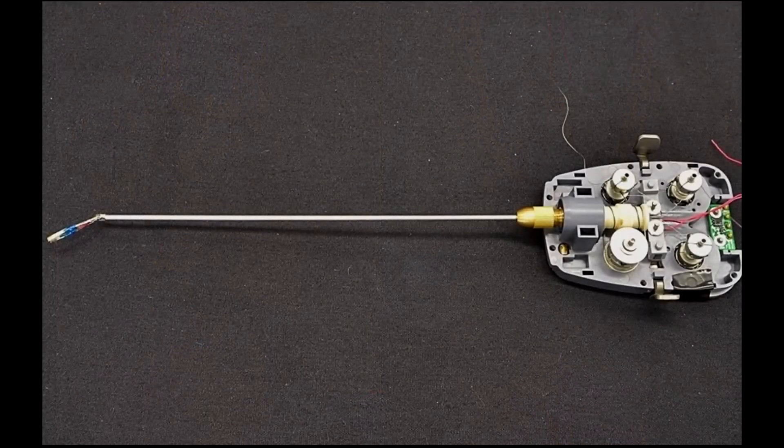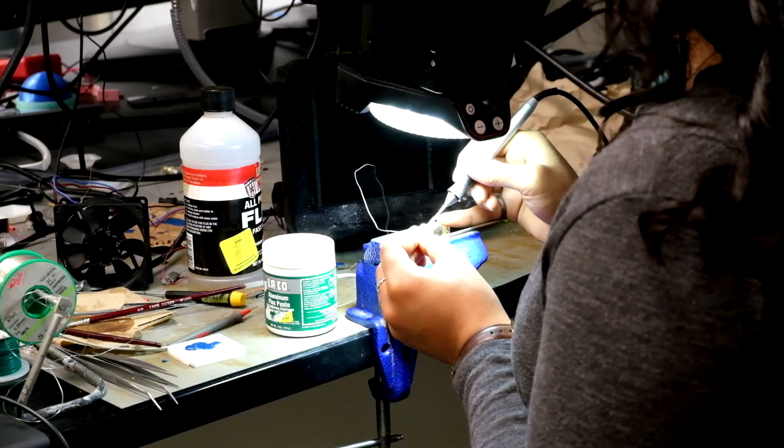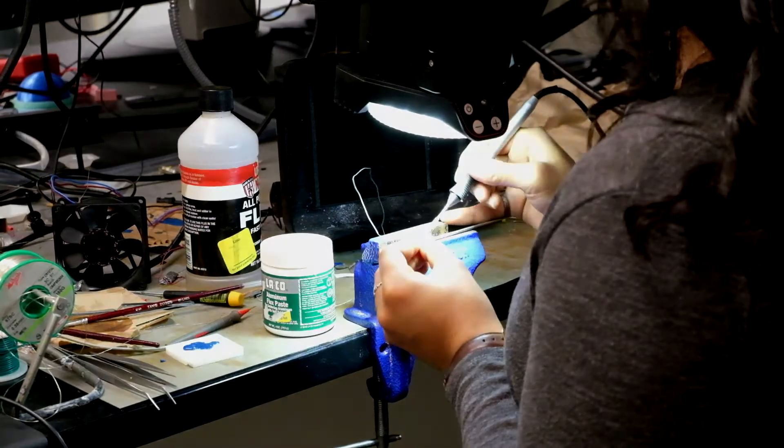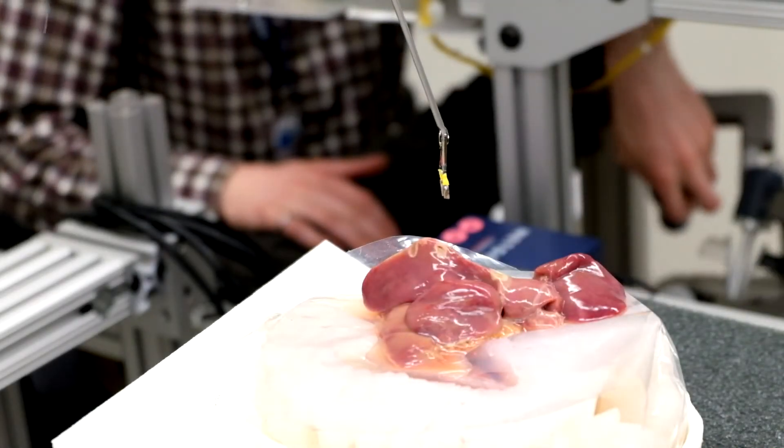For increased dexterity, a cable-actuated revolute joint is added proximal to the forceps. All construction and assembly of the BRN tool was done in-house. Here we demonstrate the working principle of cauterizing with the tool.